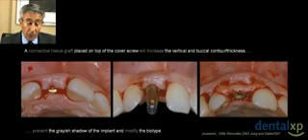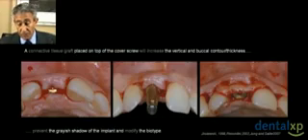but you can see that on the site where we have put our bone graft, membrane, connective tissue graft, that we have a nice tissue here, a nice bulk of tissue. And this is the final result of this very important restoration, combining teeth and implant.